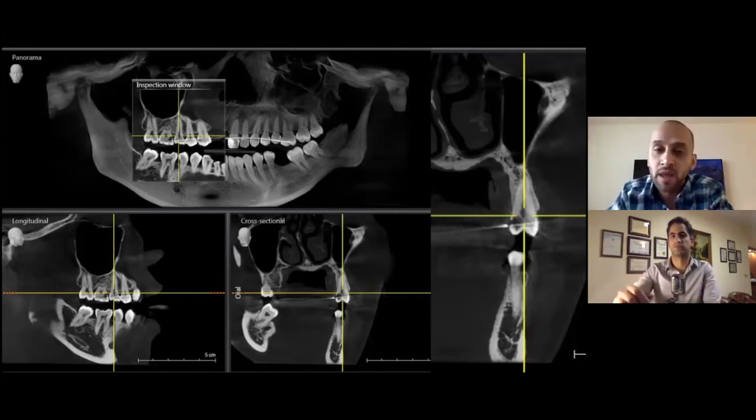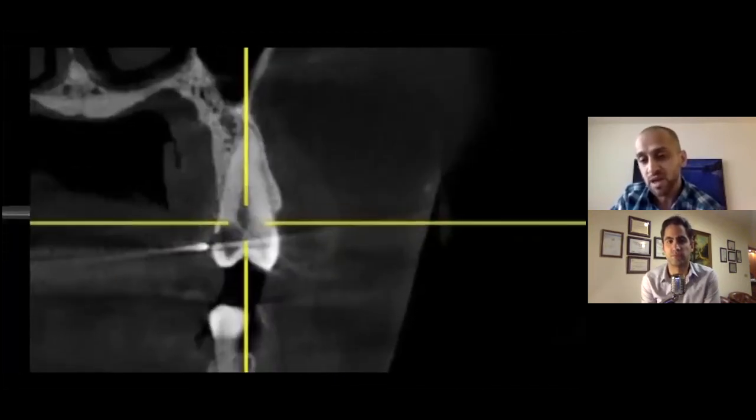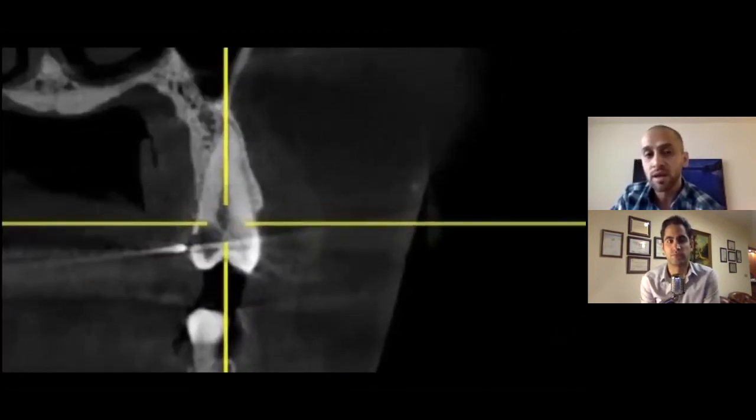In the beginning, probably because of the anatomical constraints. For example, let's look at this CT scan cross-section, right? Most implant surgeons, especially people that are into immediate placement, immediate loading, know that you must always fish for the most amount of bone to get your primary stability. That's the first thing that a surgeon looks at. How much bone do we have? How can I get my primary stability? Where can I get my fixation of my fixture?